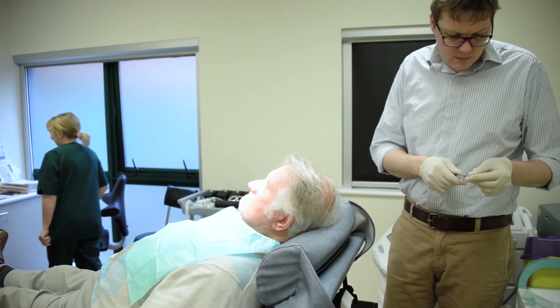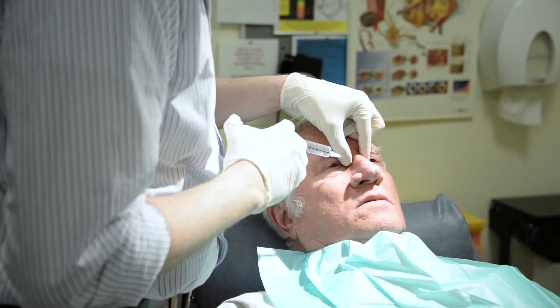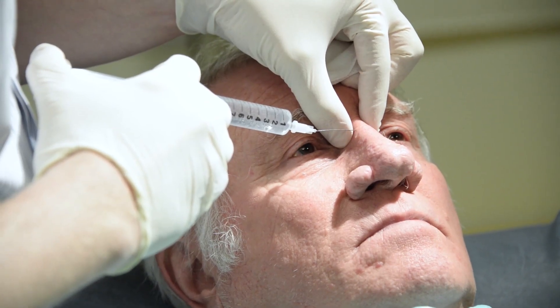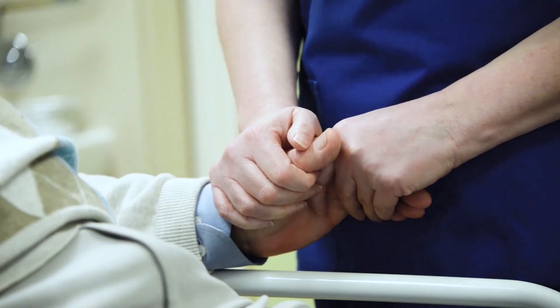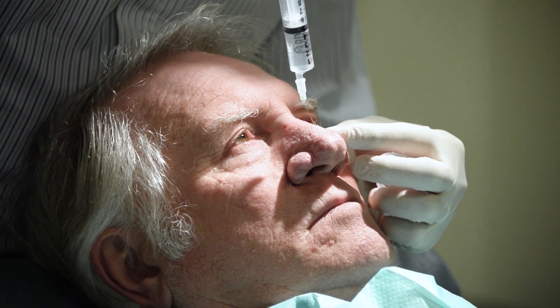Injection begins in the glabella region, infiltrating as the needle is advanced toward the right alar base. The needle is almost completely withdrawn, and then infiltration is continued toward the left alar base.